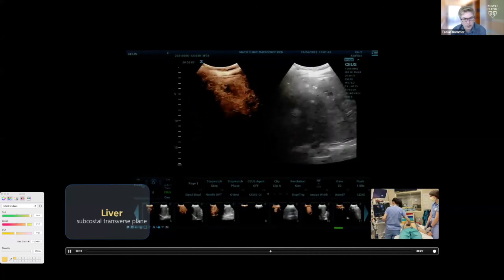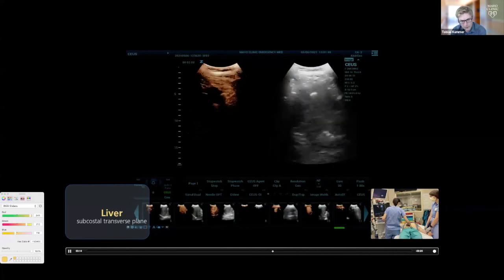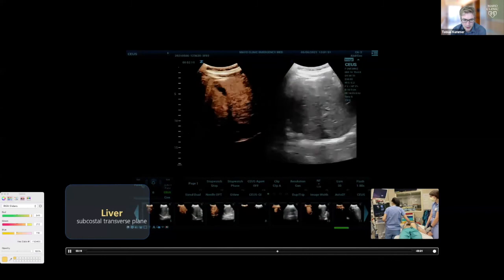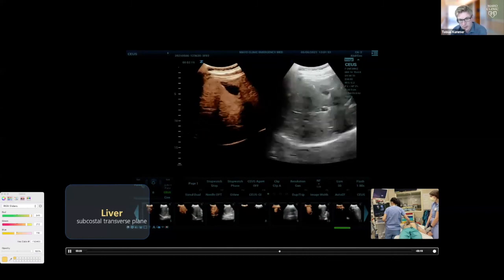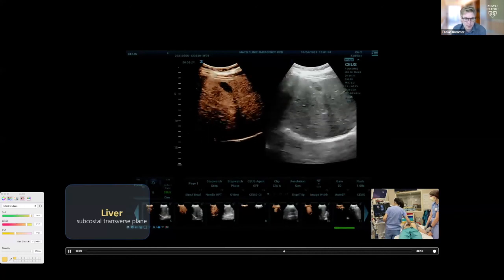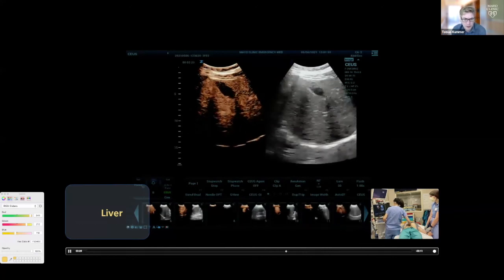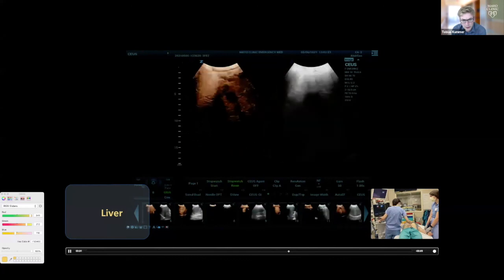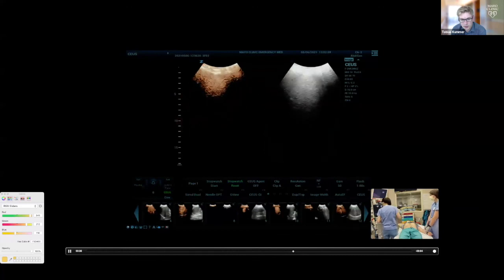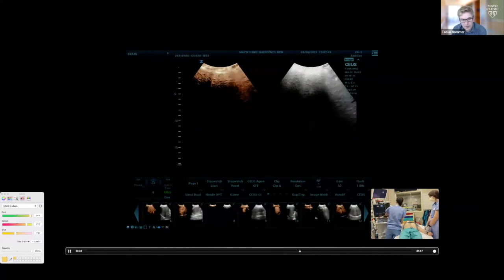And we're at 2 minutes right now after injection. Then we would move over to the other side and do the second injection. Depending on how big the patient is, sometimes you still have a lot of contrast left over from the first injection, and you can start investigating the left kidney. Typically, this would be the point where we would give the second injection, because most people don't have that much contrast. But in this case, it's me. I guess I have a slow metabolism, because there's actually a lot of contrast still.